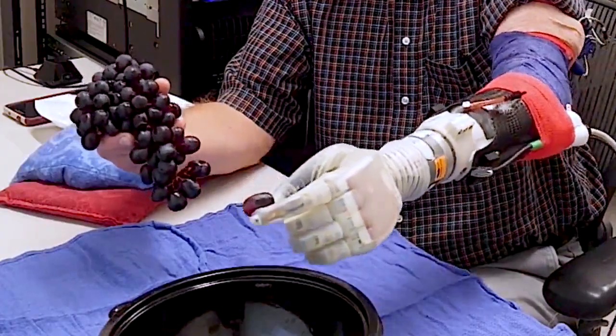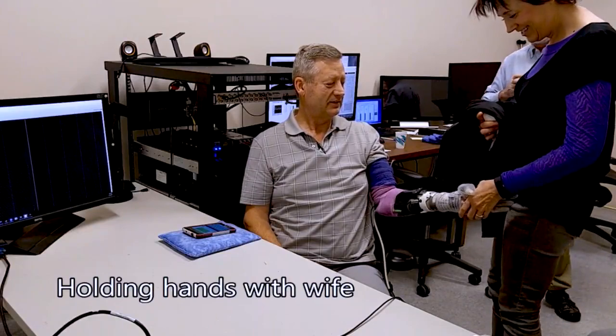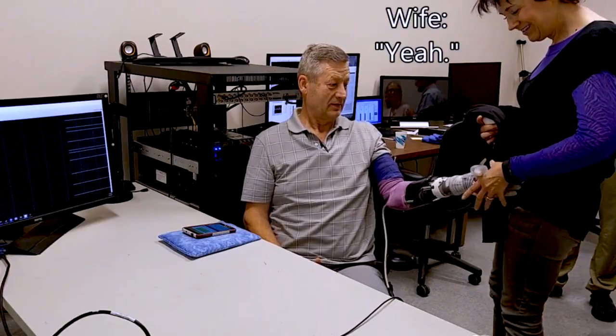Imagine shopping for produce without being able to feel if something is ripe or never really being able to shake someone's hand. This prosthesis and all of the math behind it make those small moments possible for an amputee.